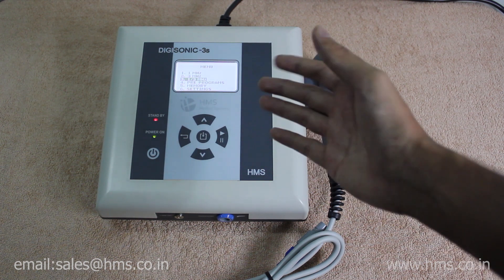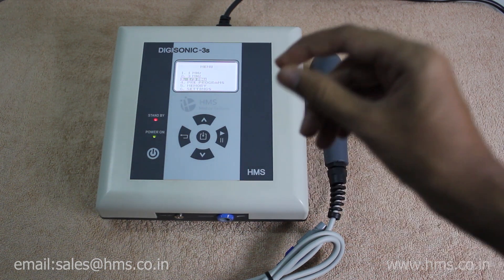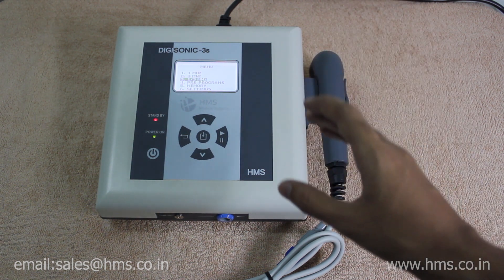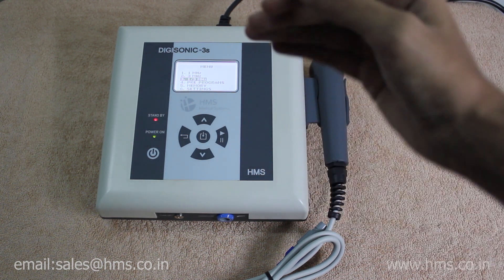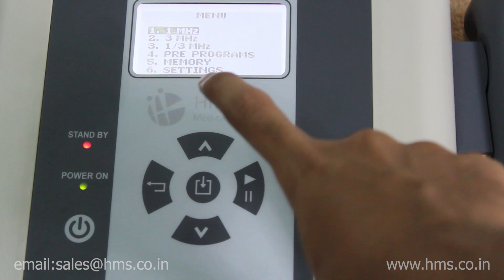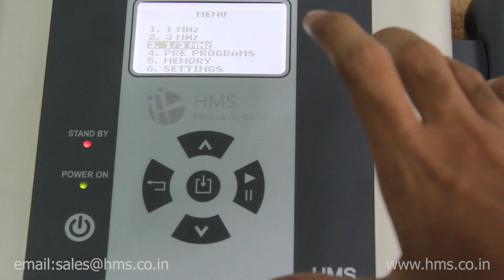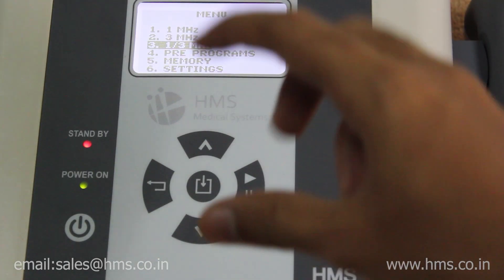The Digisonic 3S has an option to operate at both 1 and 3 megahertz in the same treatment schedule — that is the unique feature of the Digisonic 3S. There are a total of six menus, and the 1+3 MHz mode is what separates it from its previous Digisonic 2S model.